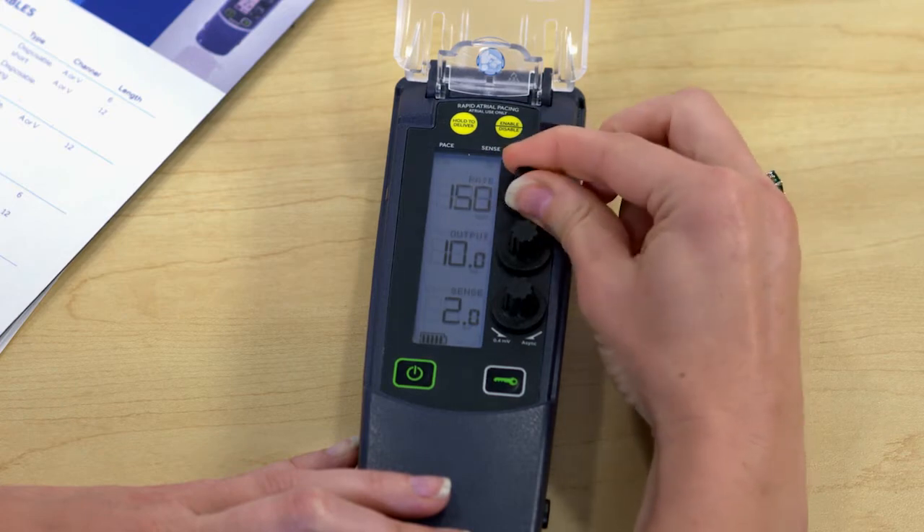For output, it's a constant current device, which allows more consistent capture and maintains the pacing threshold. Constant current refers to keeping the milliamps constant even if the lead impedance changes. Lead impedance can vary due to many factors such as changes in blood chemistry, medication effects, metabolic imbalances, and other changes in the patient. Think of constant current like cruise control in your car — when the car goes up a hill, it automatically adjusts the accelerator to maintain speed. On this device, if the lead impedance increases, the voltage automatically adjusts to keep the same output.